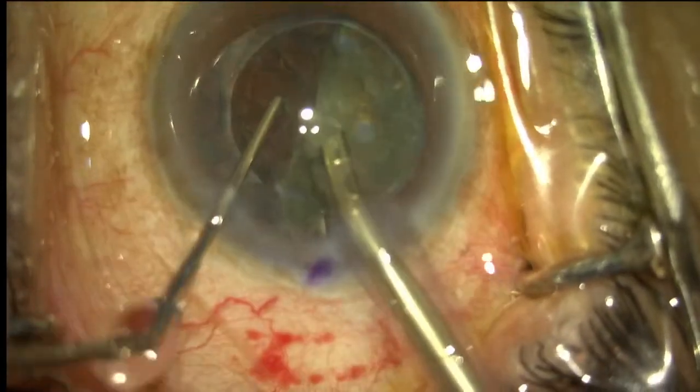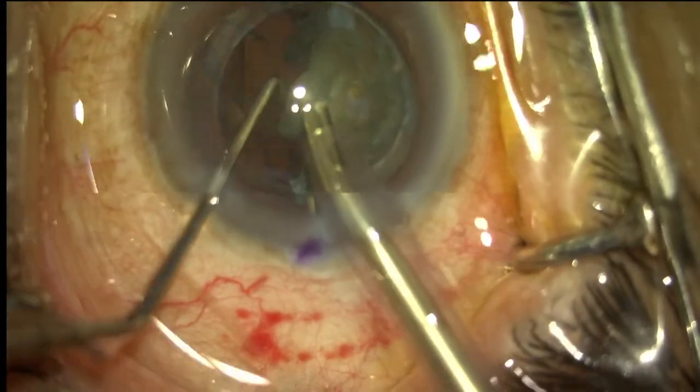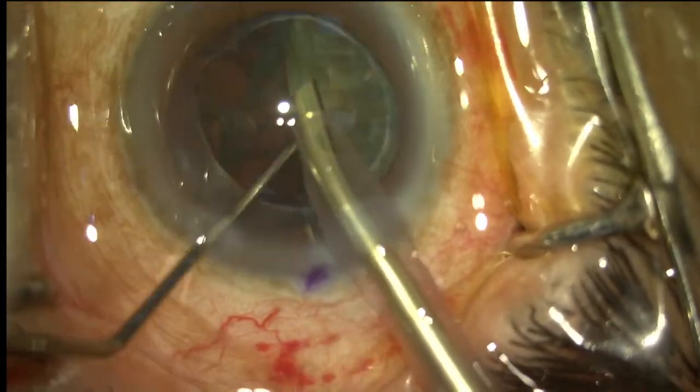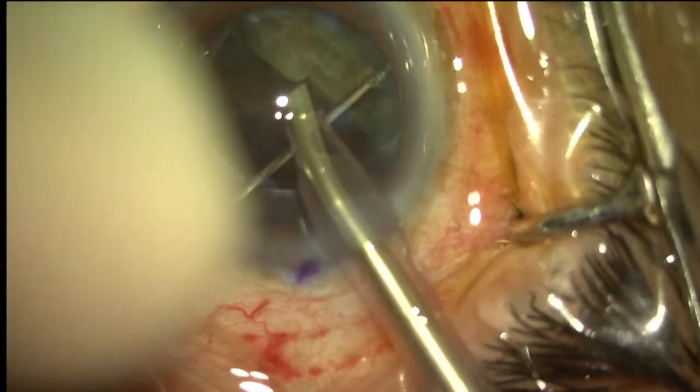You can see that with the Signature Pro, as the other surgeons have demonstrated, the chamber stability is really good. There's no surge and no fluctuation of the anterior chamber.